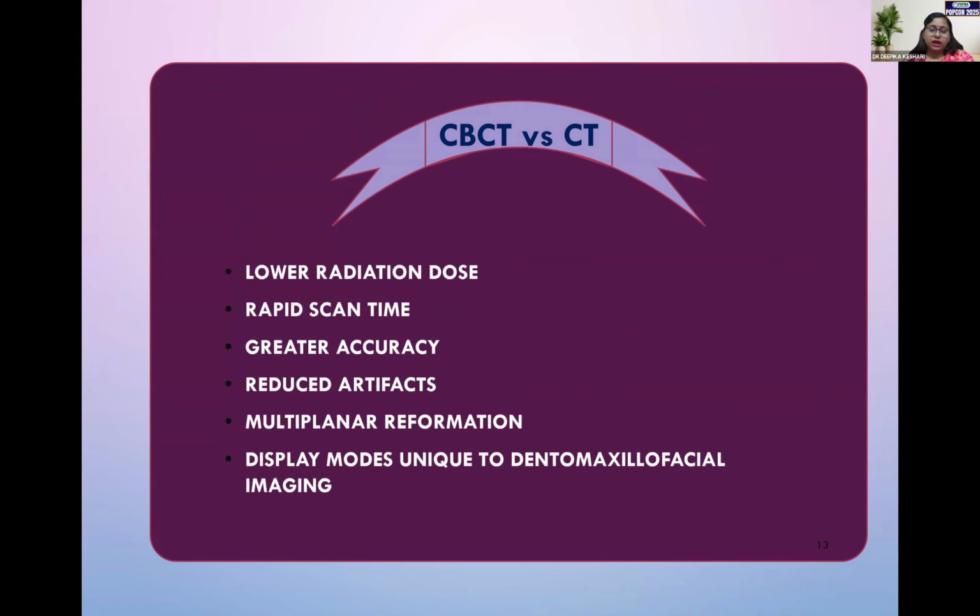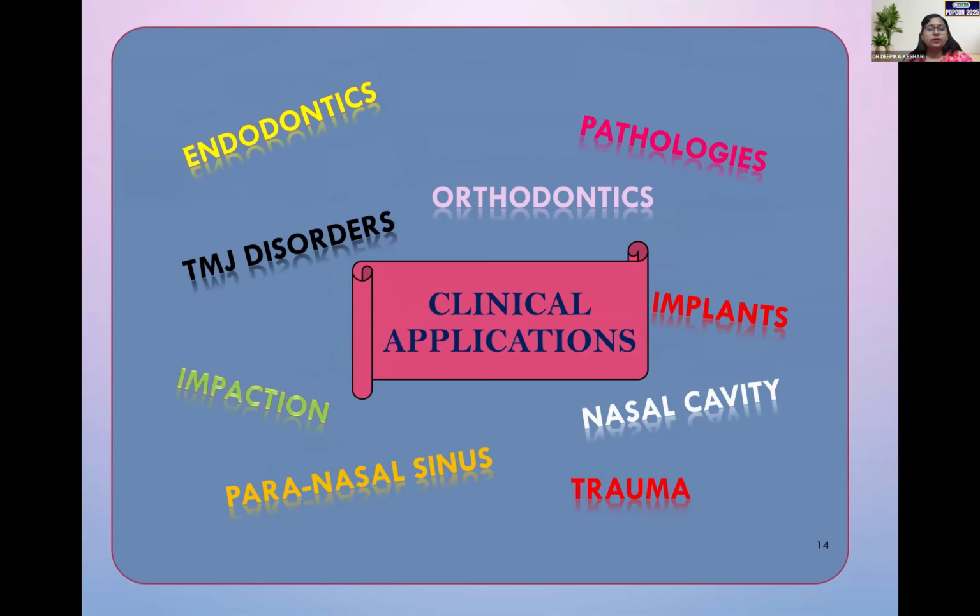CBCT has another advantage of giving a lower radiation dose to the patient, because there are different display modes unique to dentomaxillofacial imaging. And also there is rapid scan time, it is more accurate, and there are reduced artifacts with better multiplanar reformation. Now coming to the different clinical applications of CBCT.